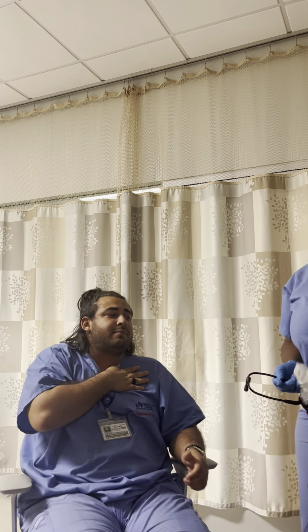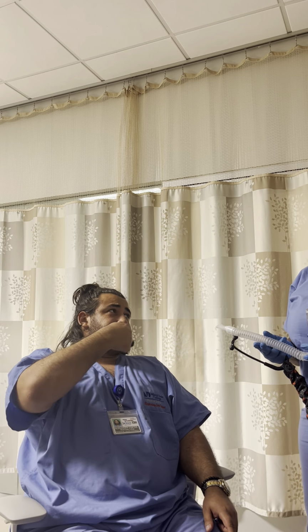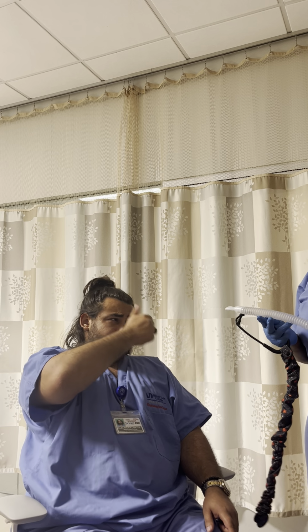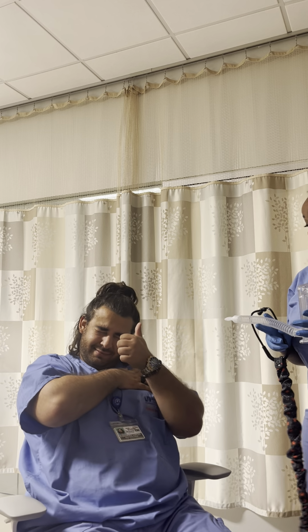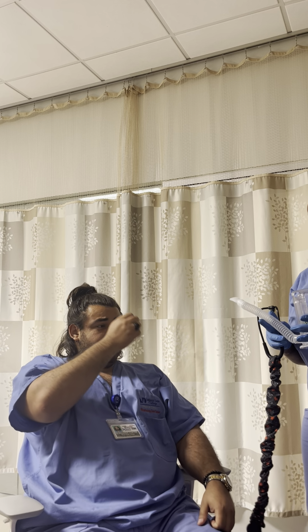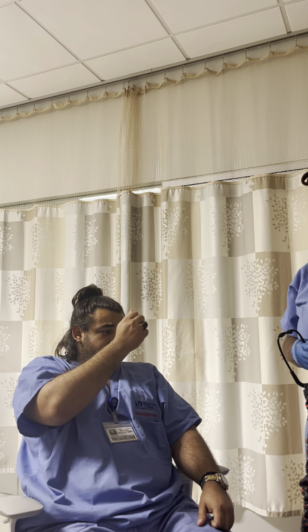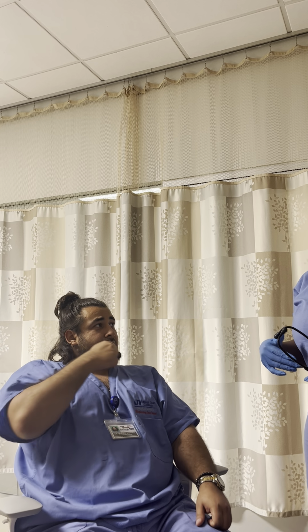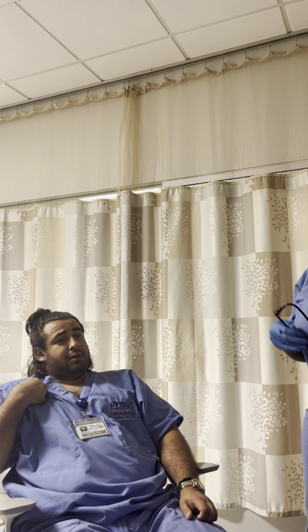So as I was saying earlier to the patient, patient Cortez, you're gonna perform this 6 to 10 times every hour. I know it might be a little tough, but it's necessary, okay? Absolutely necessary, okay? When we get to a commercial, that's when you can do it, okay?